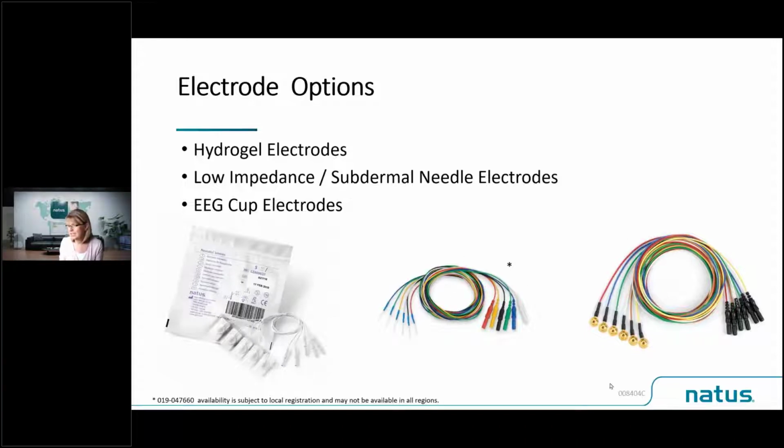The final option here is the EEG cup electrodes. Again, these can remain effective for several days. They also require preparation of the skin, but the difference with the cup electrodes is we use conductive paste, and we can reapply that during use if we need to. So again, we'll talk through all of the application points with that.